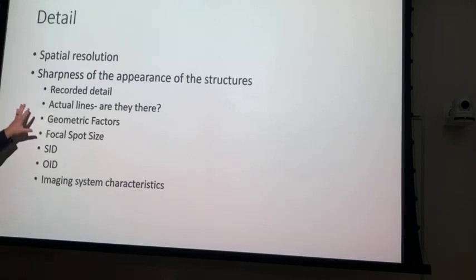And that's everything that we can do, but also there are imaging system characteristics. You know, what controls how sharp that image appears. You go buy a TV. What are you looking at in a TV? Pixel sizes. Pixels are the individual little bitty pieces to this picture, right?